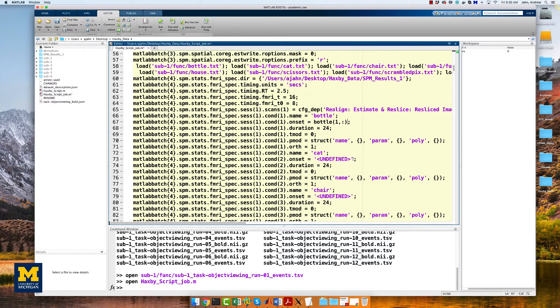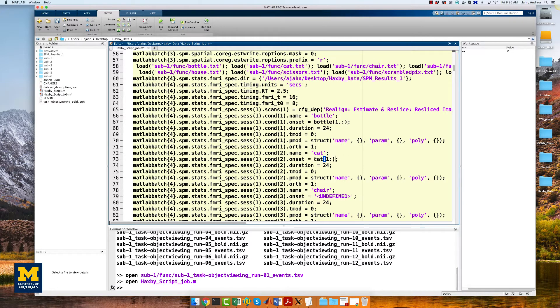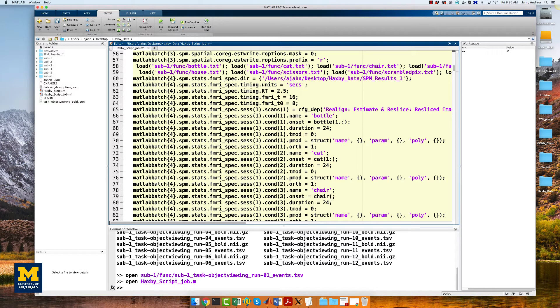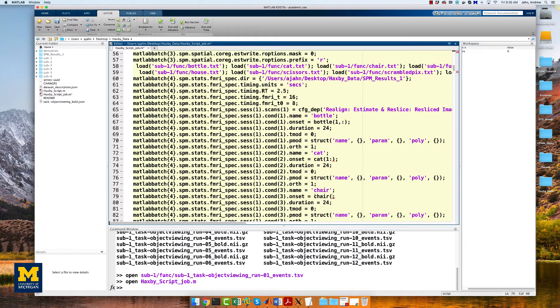We will then do this for the other conditions as well. These need to be replaced for each condition for the first run, and then done for each of the other runs. Again, this is tedious, but you'll see that once we've done it once, with slight modifications, we can run it for all of the other subjects.